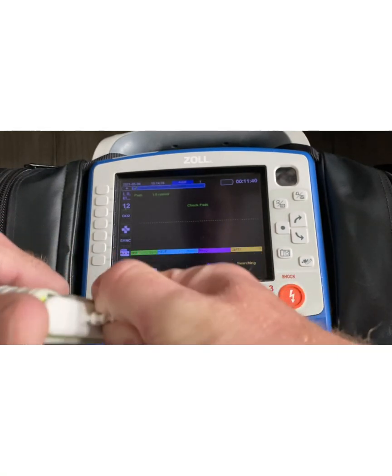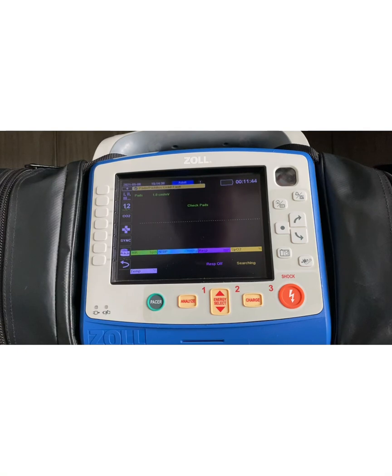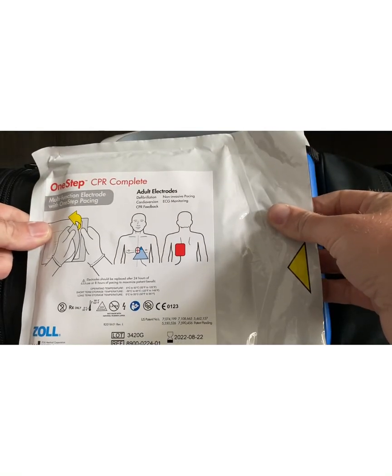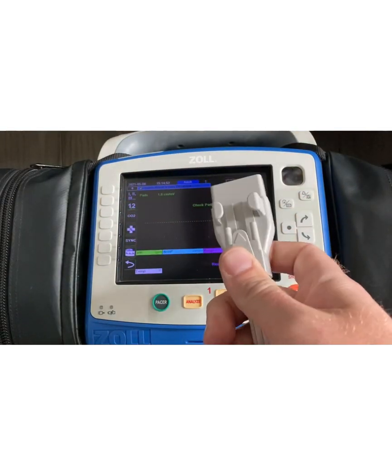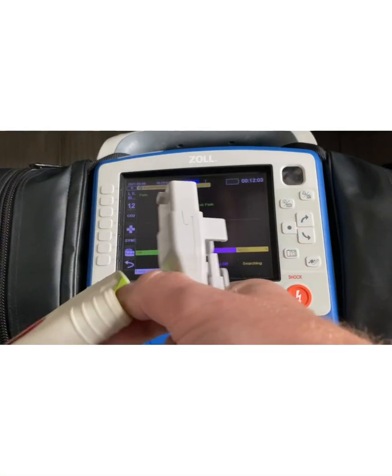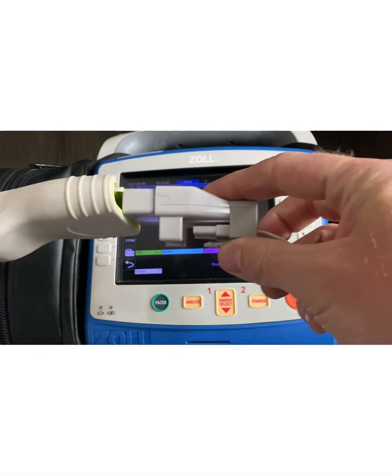What we're seeing more and more Zoll-equipped hospitals providing in Illinois are what are called one-step pads. A one-step CPR complete adult pad has this connection. You may have come across this recently. If I try to plug these two together, they don't fit.